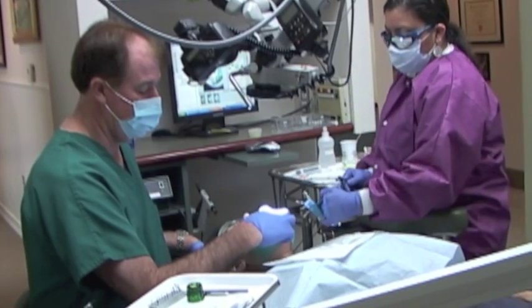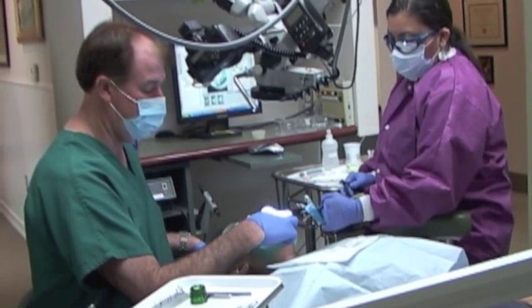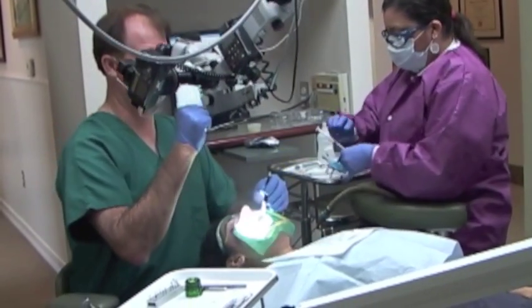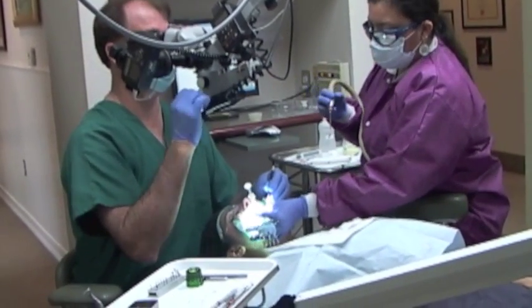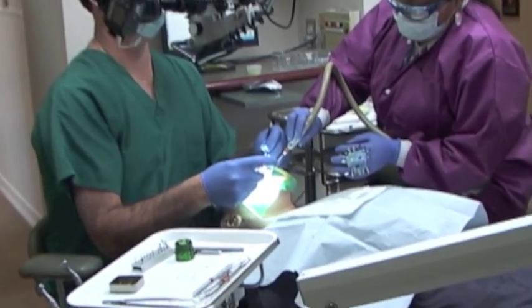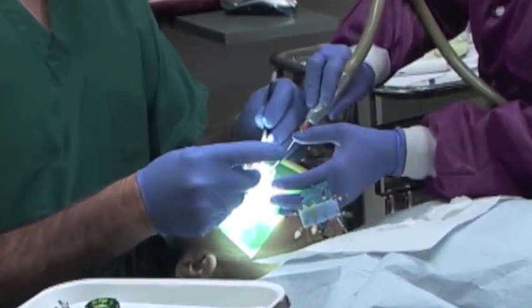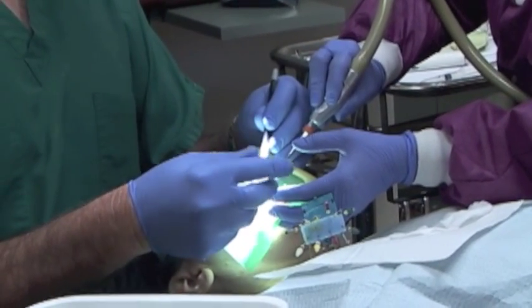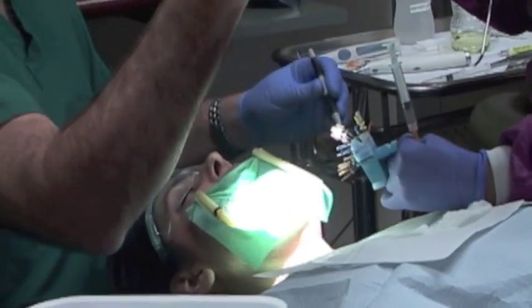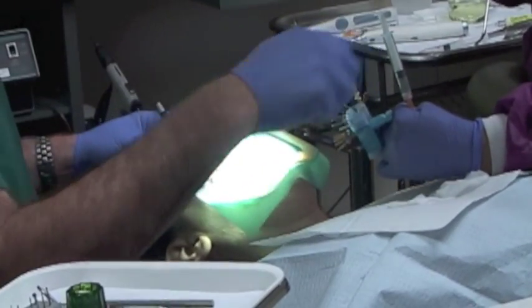It's not as abrupt a bump as it was. Filing motions back and forth. At about this point, I'm going to want to use some irrigants — full strength. Flushing it just liberally, it's right up to the brim of the prep. Passing it to my assistant, scope out of the way.